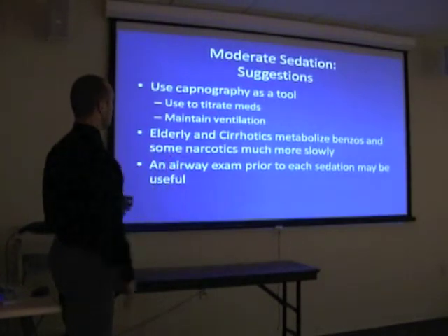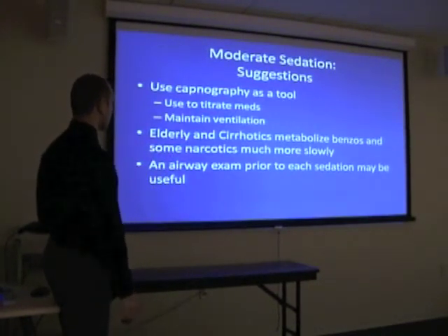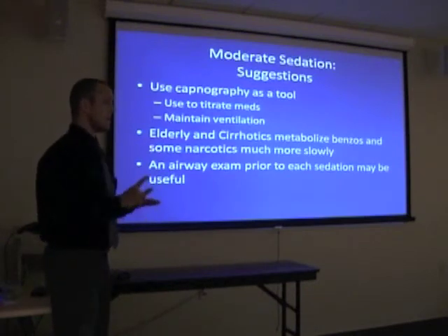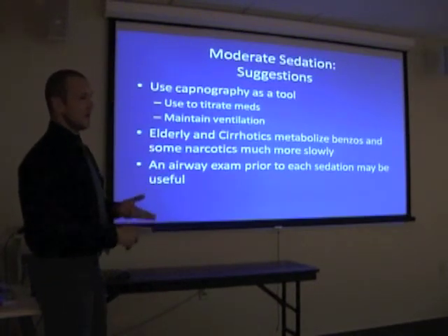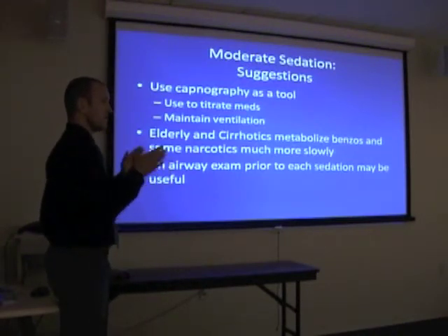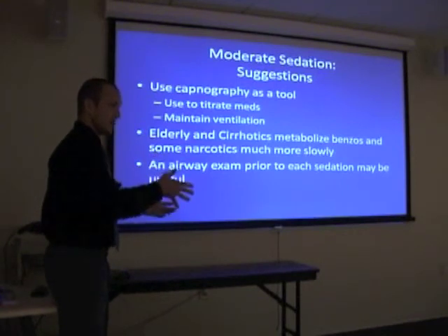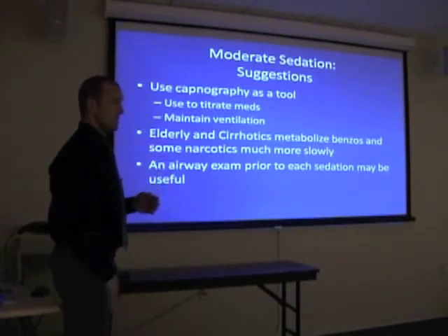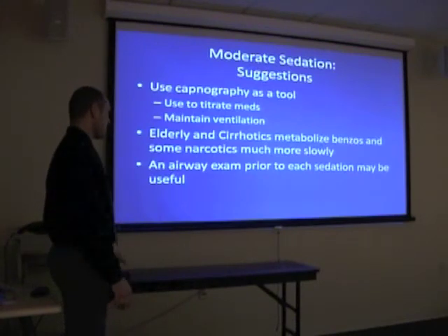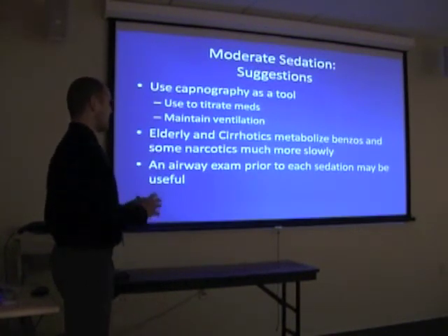And then with the moderate sedation, what we tell the nurses is to use it as a tool, use it to titrate meds, to monitor ventilation, but it is not absolute. Just like pulse oximetry, that's a little more definitive, but you still use it along with the whole clinical picture. So you can't say definitively that the patient's not ventilating until you look at the patient, make sure their nasal cannula didn't fall off or whatever. You have to use it as a full clinical picture. And like I said, with the elderly and the cirrhotics, benzos and narcotics are metabolized much slower. They're much more sensitive to them.